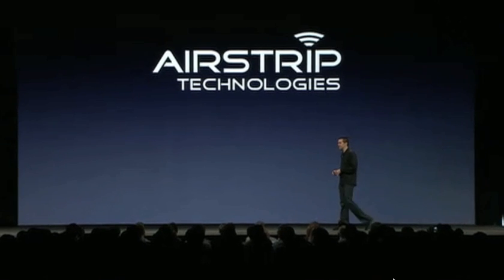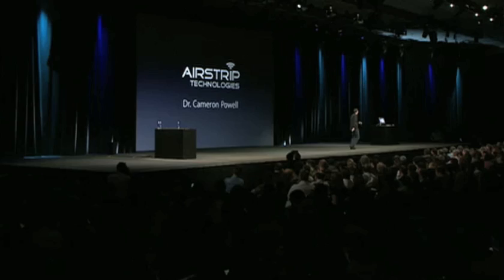Airstrip Technologies creates medical software that allows healthcare providers to monitor patient data on their mobile devices. To show you some exciting new work they're doing for the iPhone, I'd like to invite up Dr. Cameron Powell. Dr. Powell?